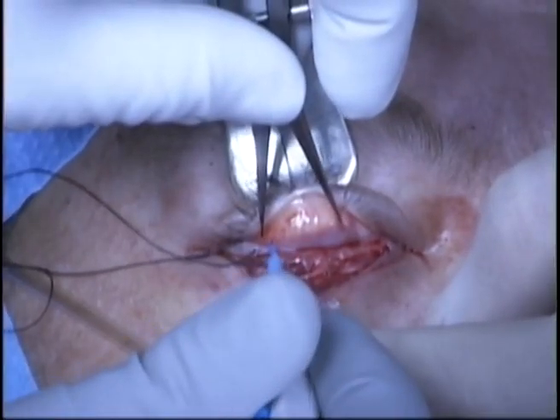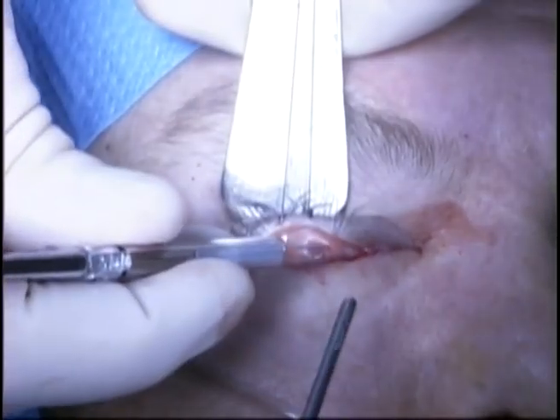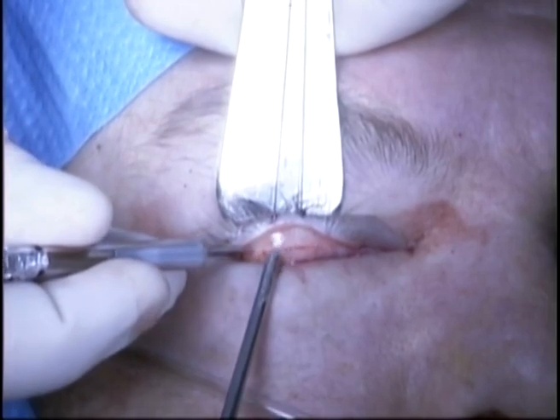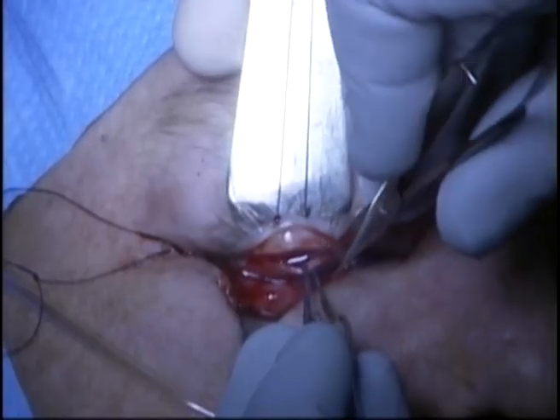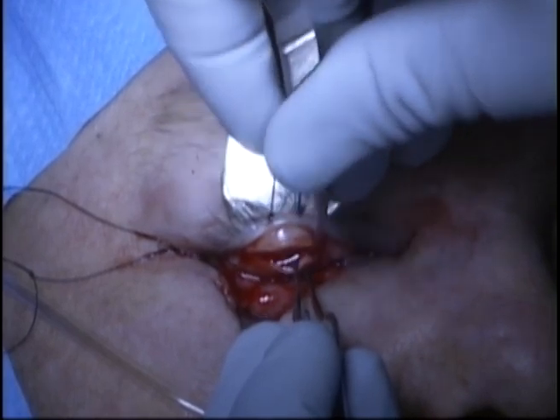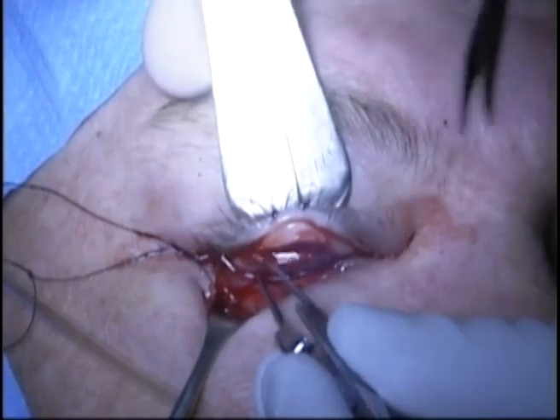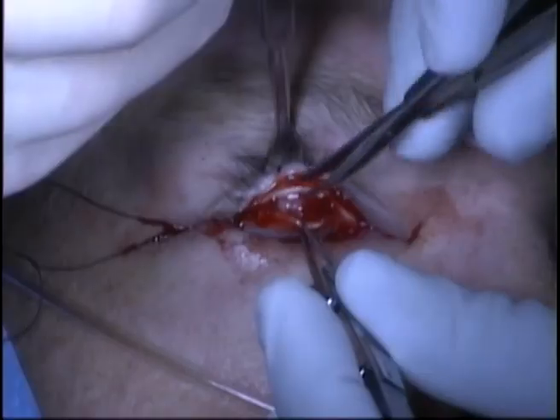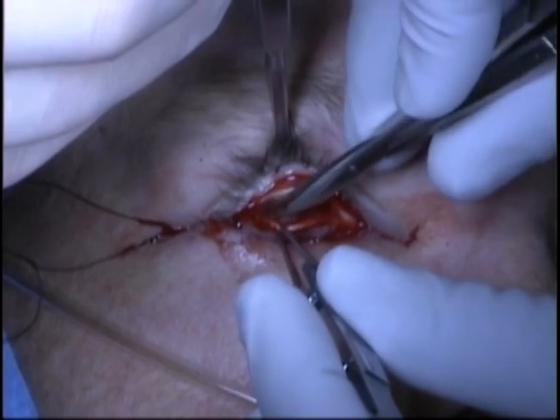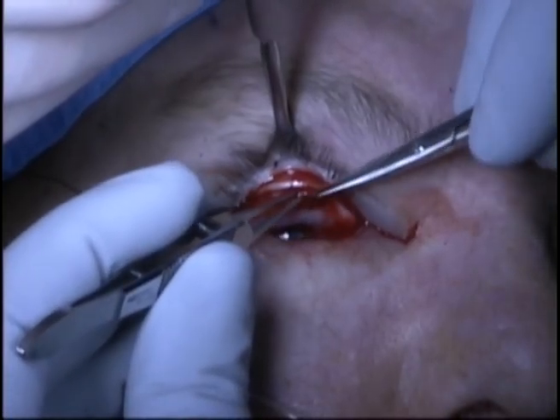The amount of tarsus needed is marked with the monopolar cautery. A 15 blade is then used to make an incision four millimeters superior to the inferior border of the tarsus. Westcott scissors are then used to harvest the graft.